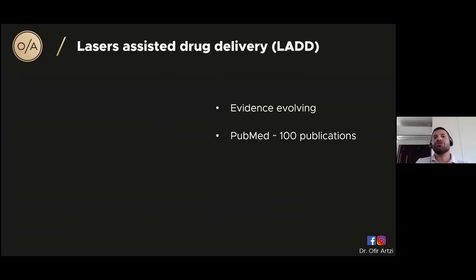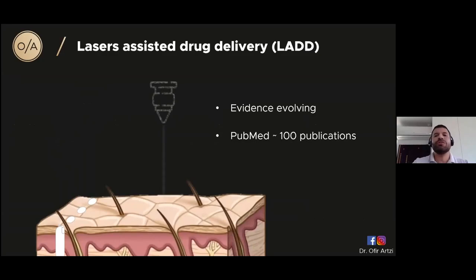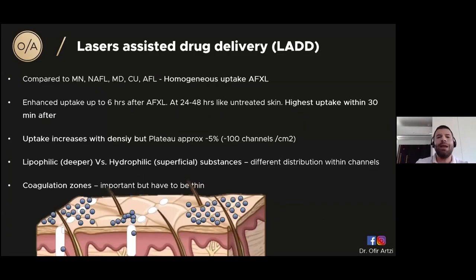So, a few words about laser-assisted drug delivery. This is, I would say, an evolving field. As compared to 15 or 20 years ago, there are more and more publications showing that if we create those holes within the skin and then apply a medication, these particles, and you can see the illustration, will get into the channels and there will be more homogeneous uptake into the skin.